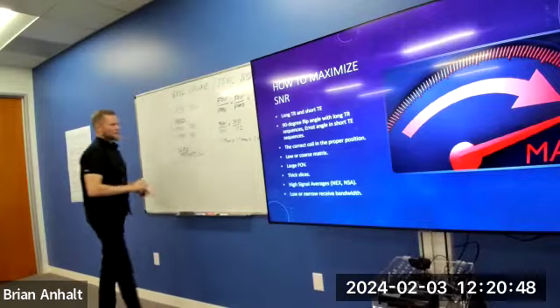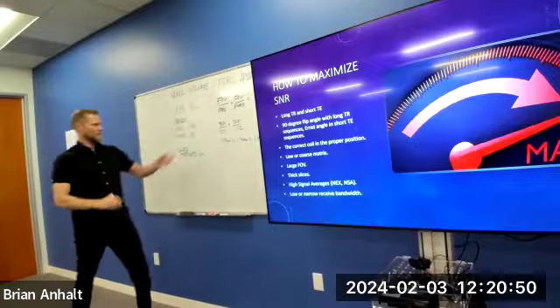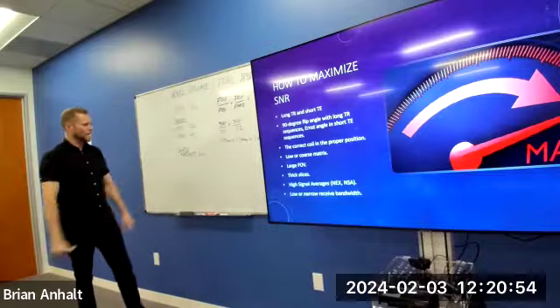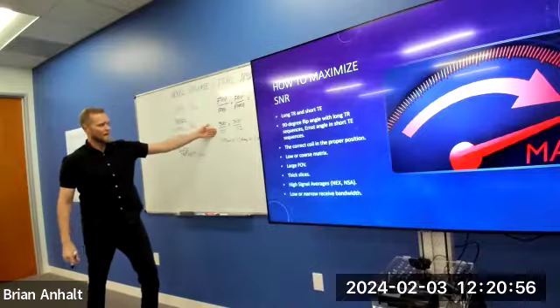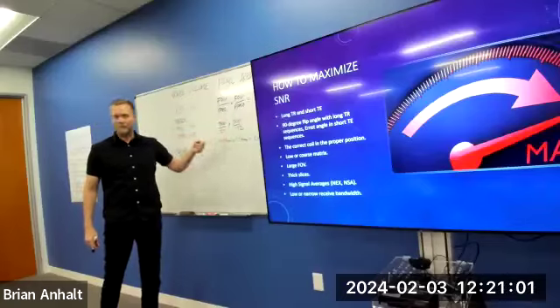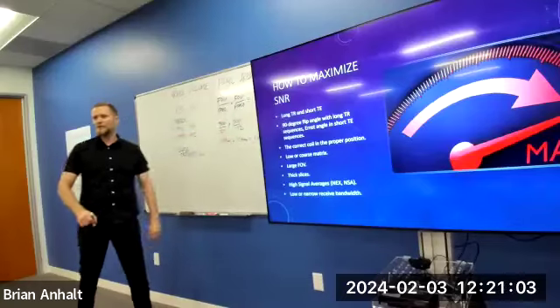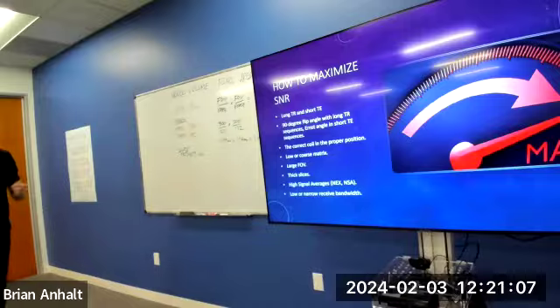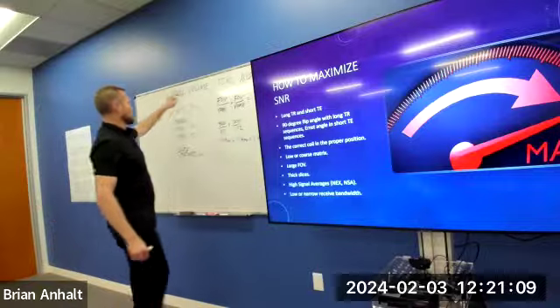The next thing you do is just divide each one of those fields of view. The field of view is gonna be the same, because it doesn't change, it's the same in each direction. It's a square field of view divided by the frequency matrix. Get that number, divided by your phase matrix, get that number, multiply those together. That is your pixel area. Got it? All right, now how do we find out our voxel volume?